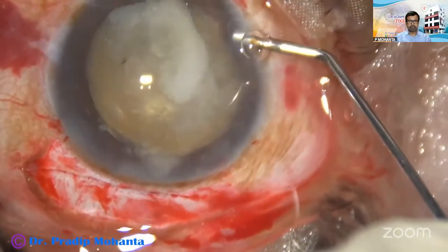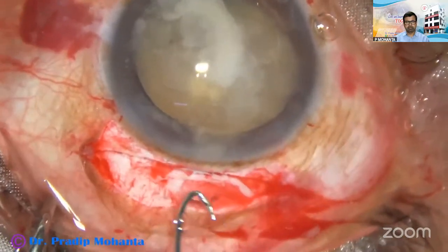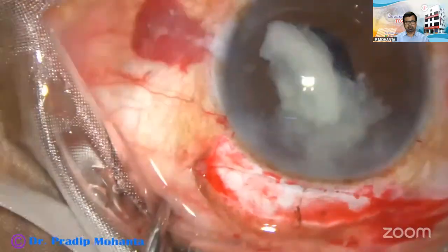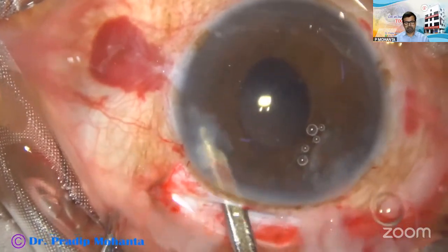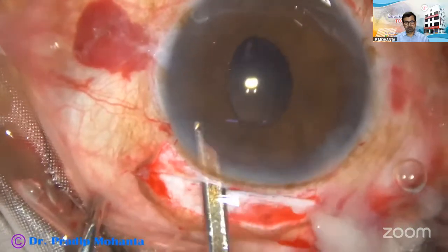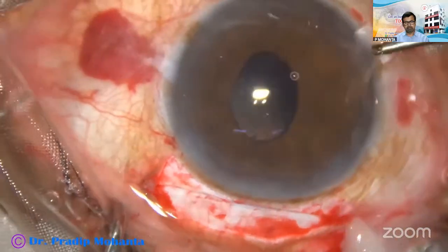Viscoelastic substance is injected both in front of and behind the nucleus. And now again I use the fish hook. The nucleus comes out very smoothly. Cortical cleanup is done and an intraocular lens is placed in the sulcus.